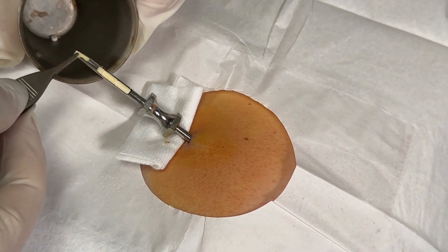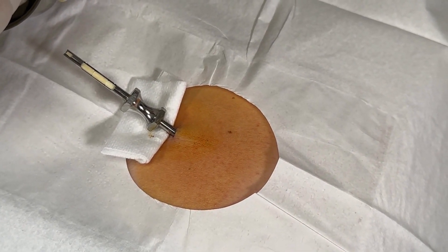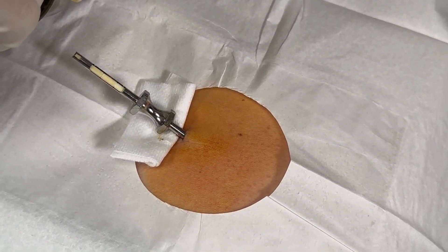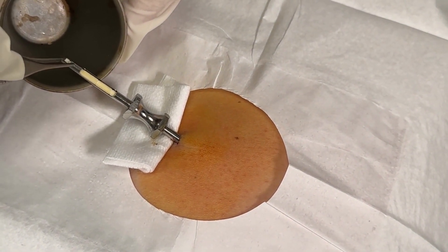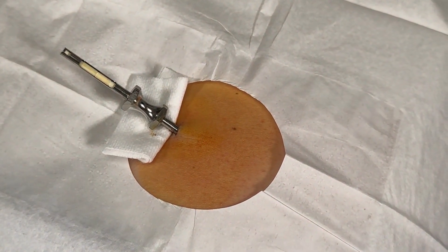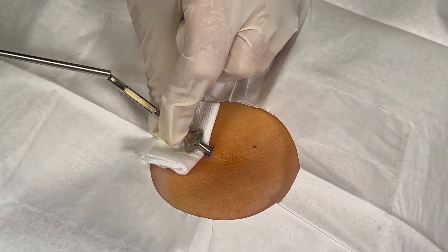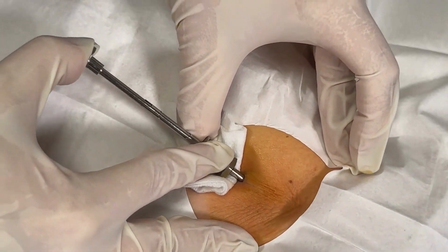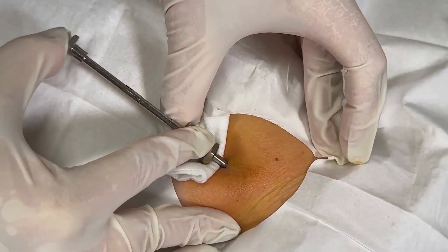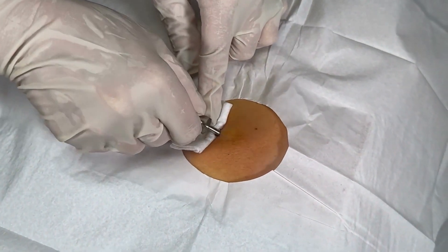As far as aftercare goes, you cannot soak in any kind of water — no pools, no hot tubs, no swimming, no bathtub — anything like that for five days. No strenuous butt exercises either, so no pop squats, lunges, or wind sprints; avoid all of that for five days. There we go, your pellets are in.